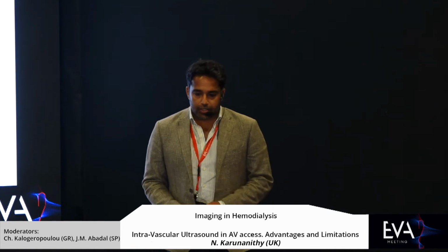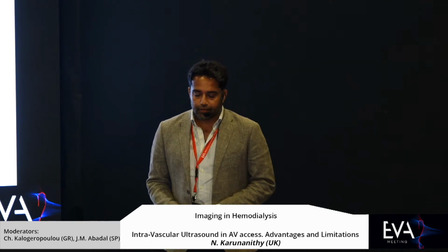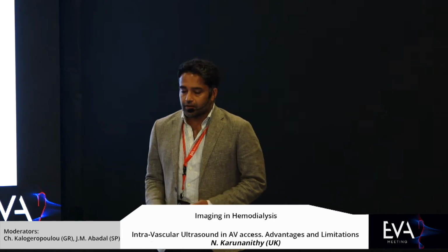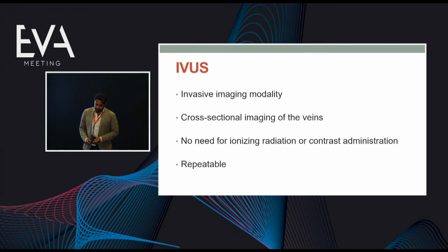As we heard, cross-sectional imaging, MR venography and CT venography form an excellent imaging modality for these anatomical locations, but CTV does carry a risk of a radiation burden. Traditional MRV techniques have involved the administration of gadolinium, so I'm really excited to hear the potential for non-contrast MR venography in this instance. And we know that digital subtraction angiography currently forms the mainstay of imaging and assessment.